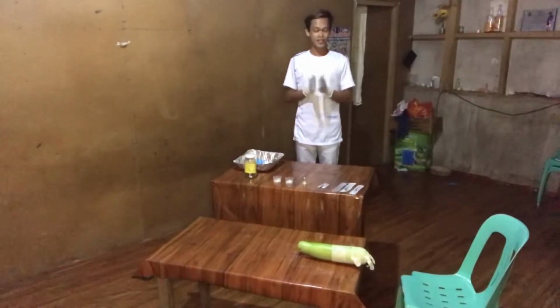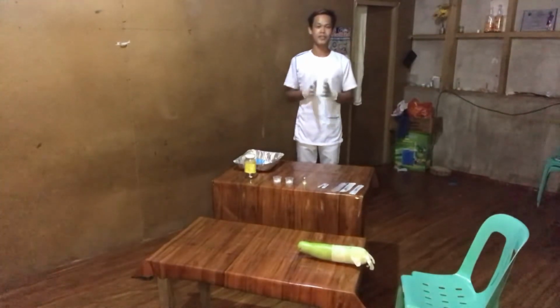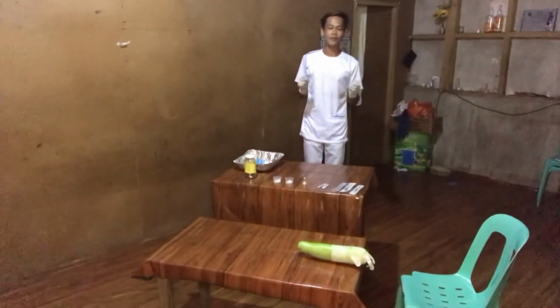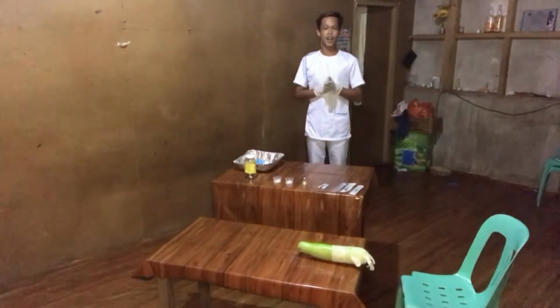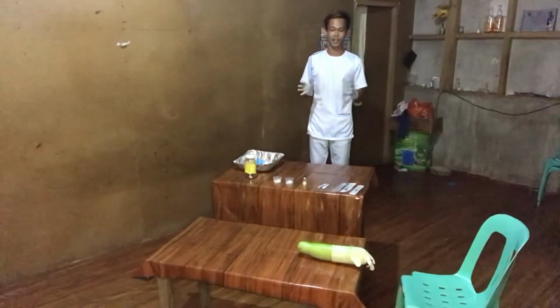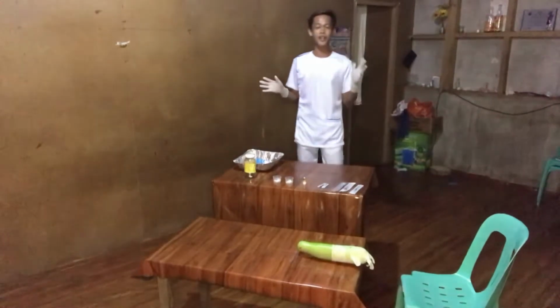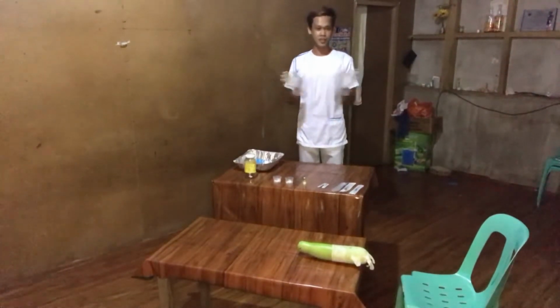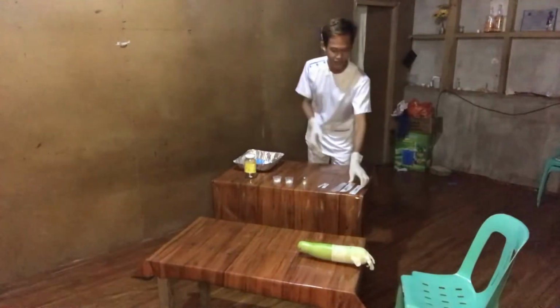I have already performed hand hygiene and privacy for the patient is now secured. As you can see, I am wearing sterile gloves for the safety of myself and at the same time for my patient. Let me first introduce all of the equipment that we need for the procedure. First, we have the syringes.